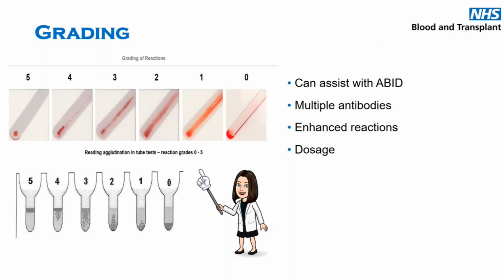Sorry, there was a comment came up there. I thought it was probably quite relevant. I missed what it was. You all right to read that one out, Danny, there? Yeah, sure. So a comment from one of the delegates: BTLP TACT doesn't let me exclude anti-JKA with an enzyme panel. So more of a comment than a question there.